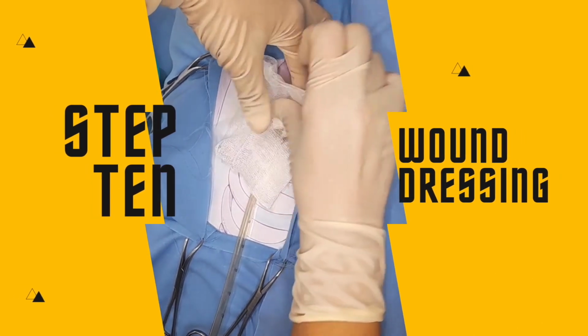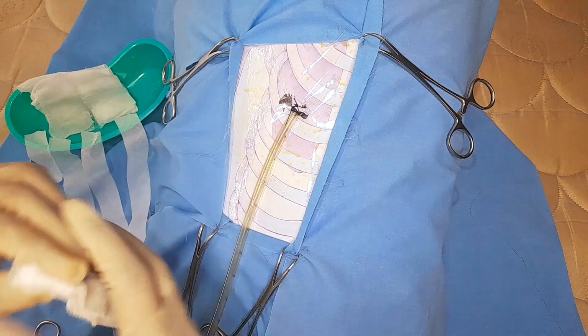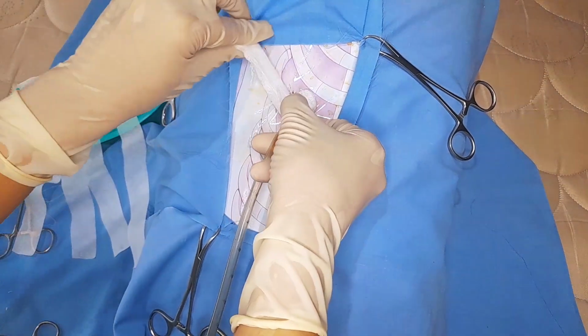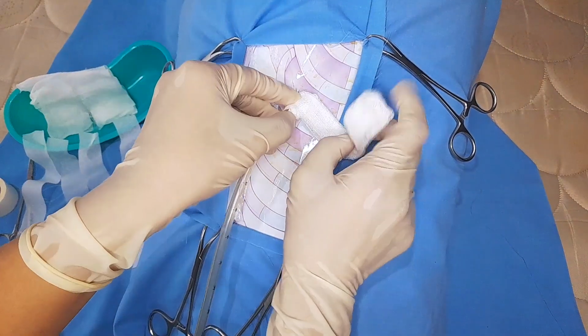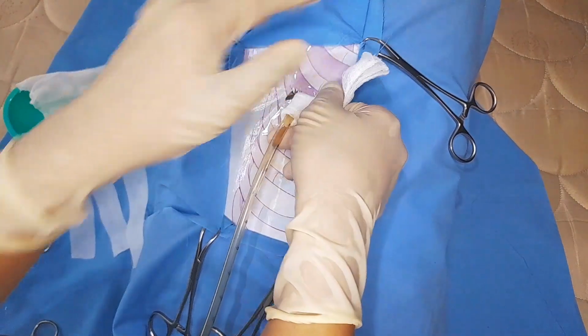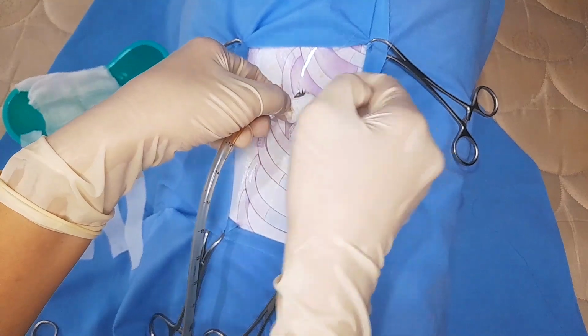Step 10. Wound dressing. Wrap the tube with the vaselinized gauze and layer 2 gauze squares with slits in a 90-degree angle from each other to avoid slipping.